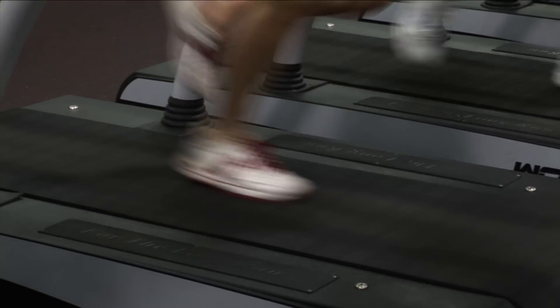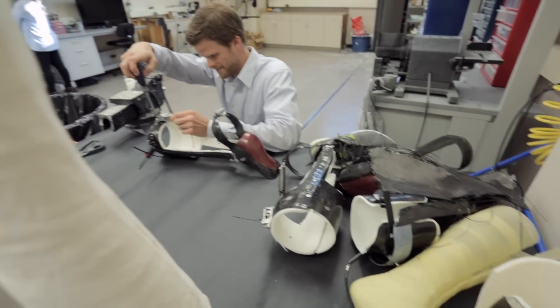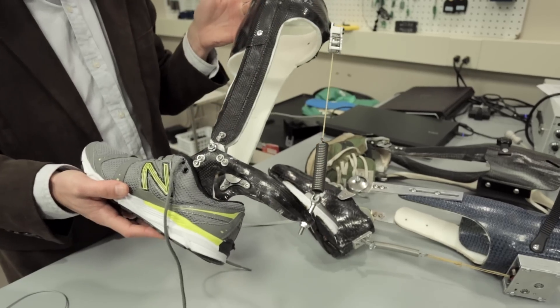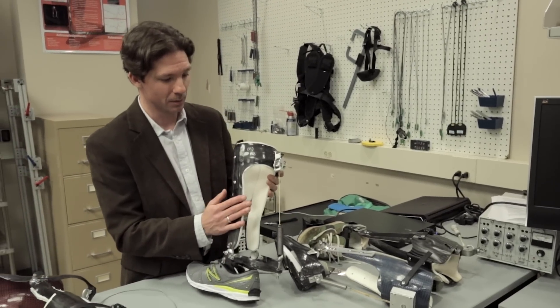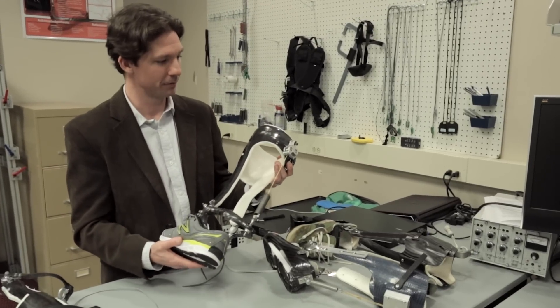The ankle is the major power source for human walking and running. Our focus is to build devices that we can attach onto people's ankles to make walking easier or more stable. What I'm holding here is a passive elastic ankle exoskeleton. It uses no battery and no motors in order to reduce the energy cost of human walking.